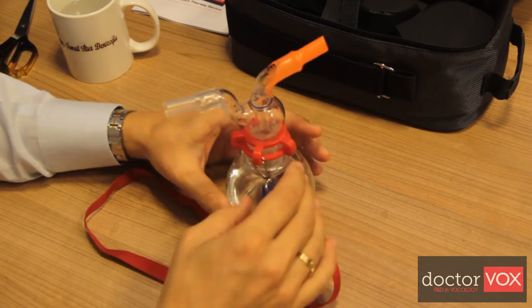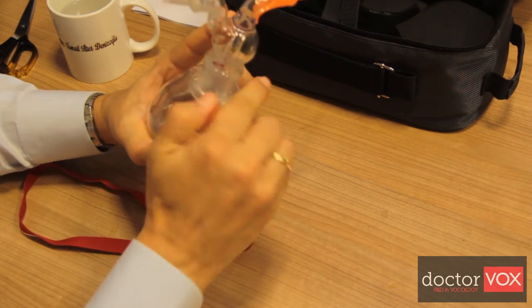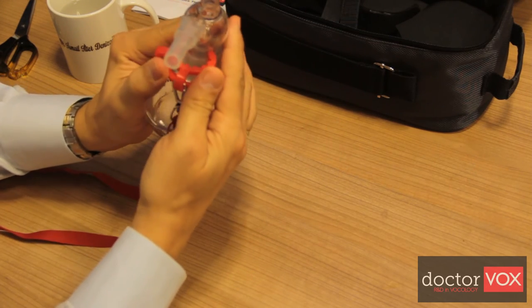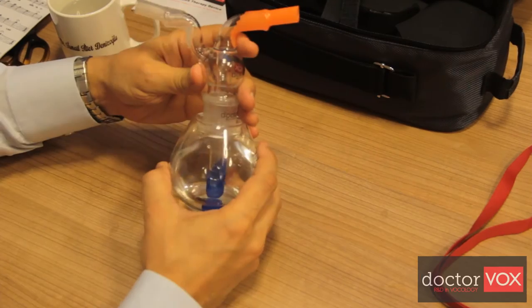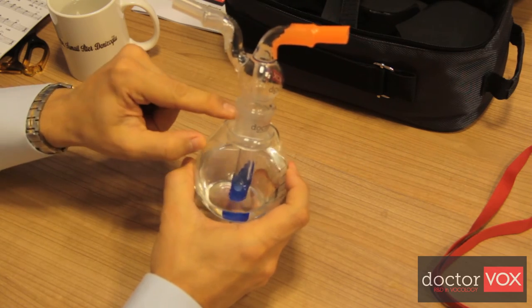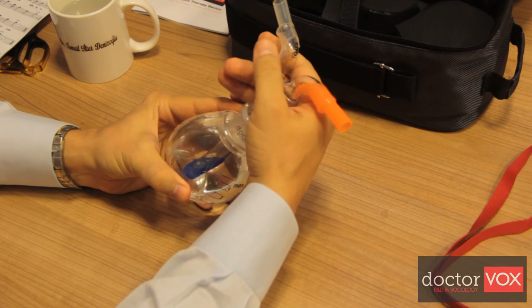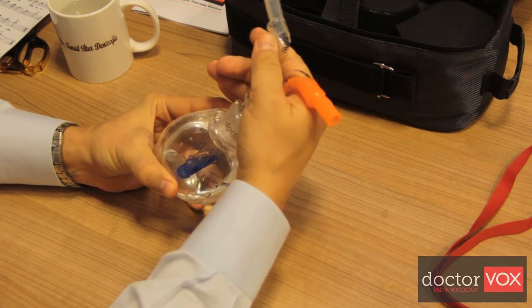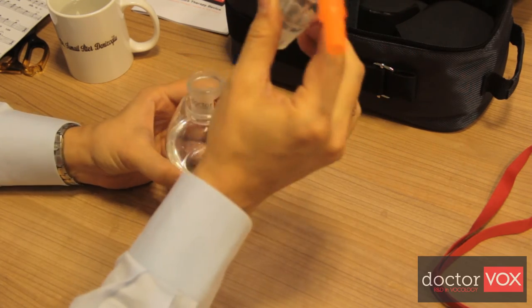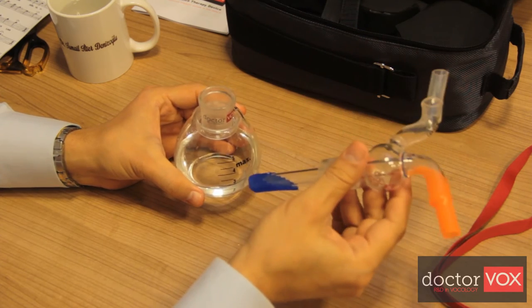It is easy to unlock the device by finger power and lock it safely. The two parts can be tightened at the level of the neck, and you can easily untighten it by turning it slightly. Then, by finger power, you can take the upper part of the Dr.Vox device out.